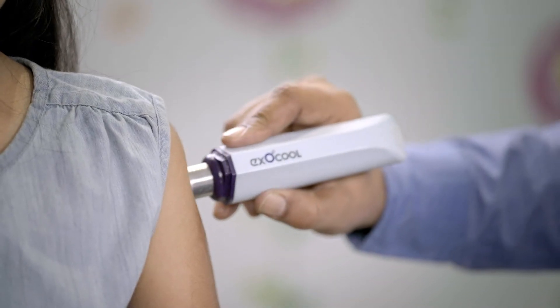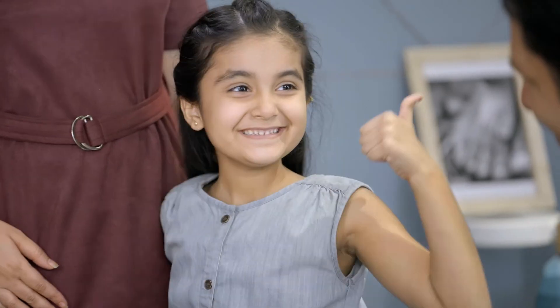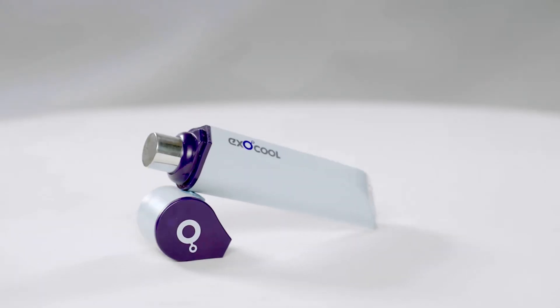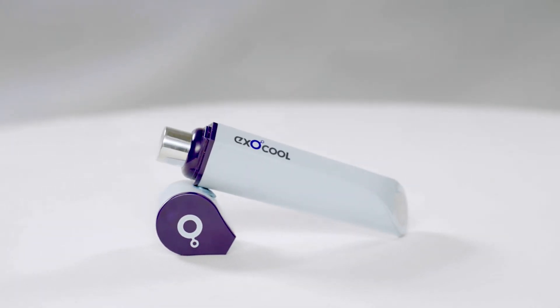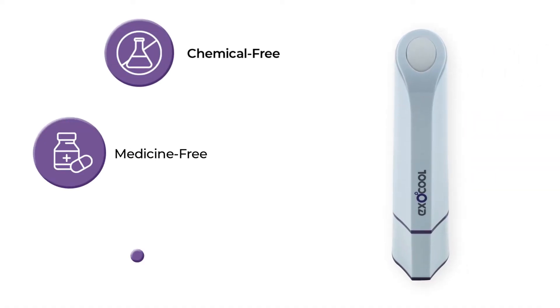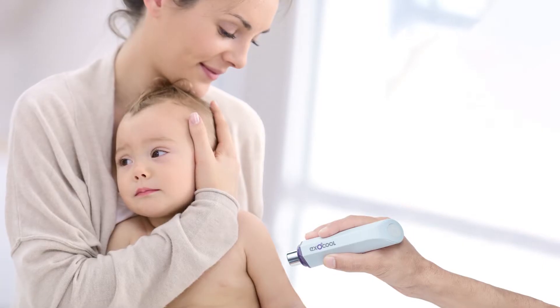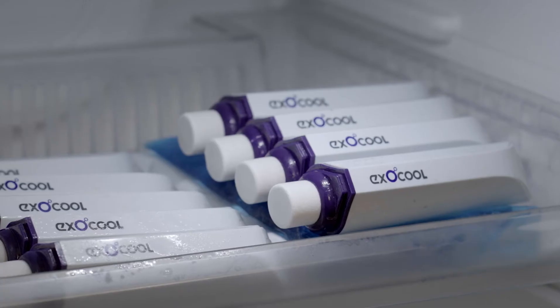ExoCool is a doctor-recommended pain numbing device. It requires just a touch to numb the skin area before the injection. ExoCool is one solution for all kinds of needle pain. It's chemical-free, medicine-free, and hassle-free. It can be used both on adults and children as it is non-invasive and painless.